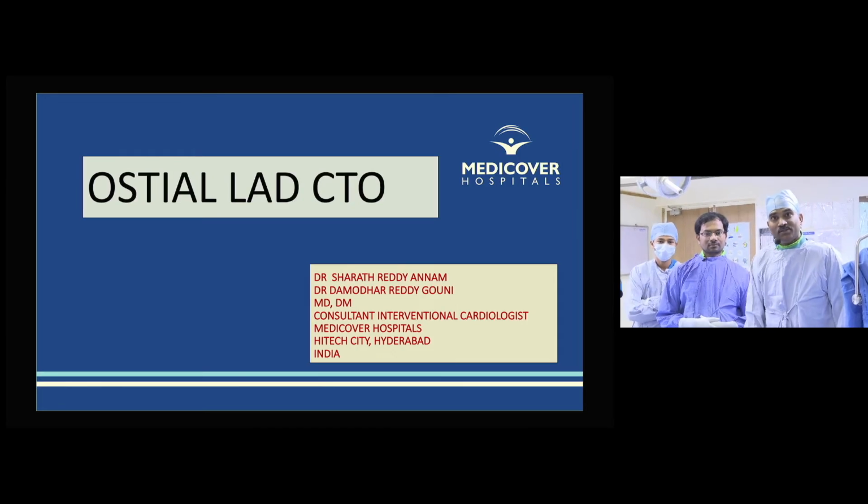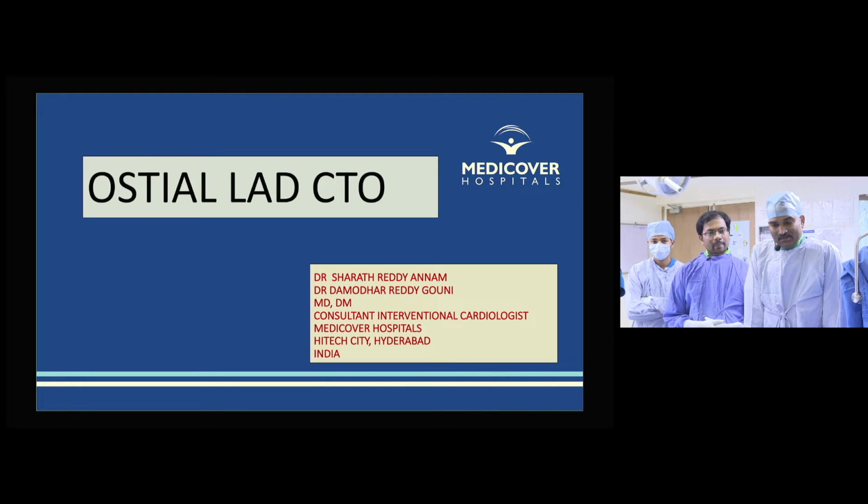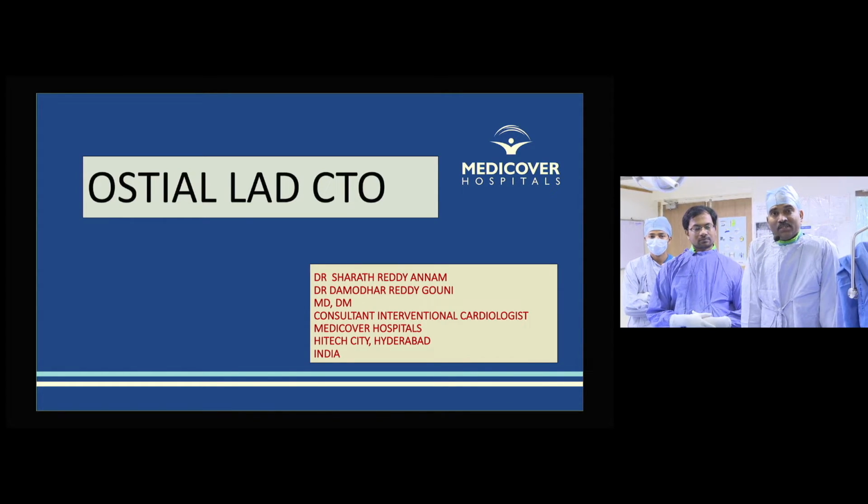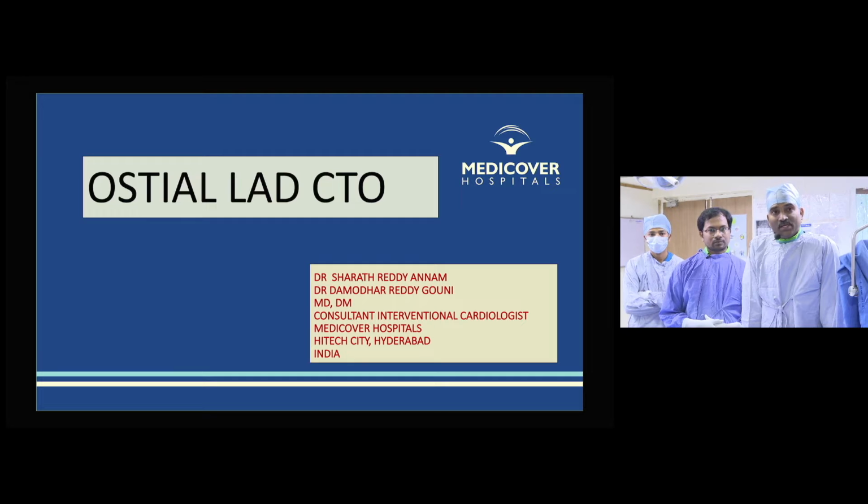So good evening. Today we are here on this platform to show one of the complex cases which we have done. That's an Ostial LAD chronic total occlusion, in a patient who underwent primary angioplasty to RCA a couple of weeks back.